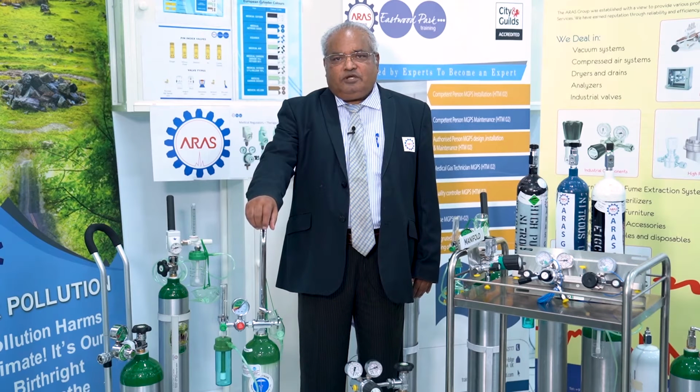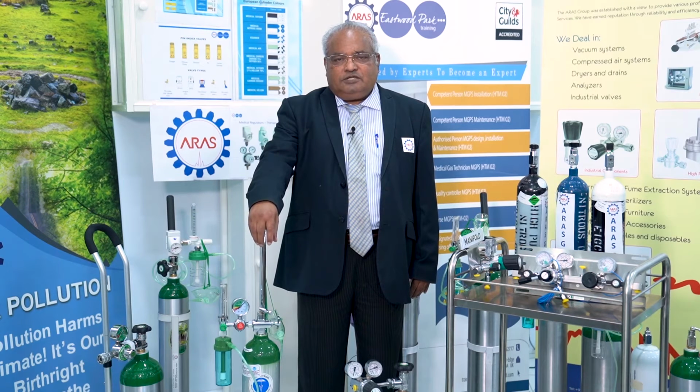That's when you have to be very precise and careful. Whatever regulator we get, it should be calibrated according to the standards and the physician's requirement for the patient. That is the difference with the single stage regulator.